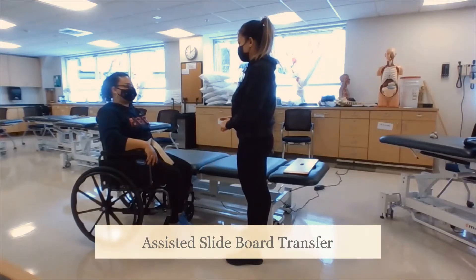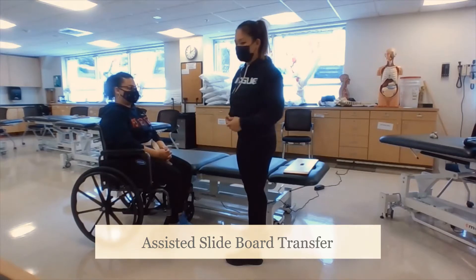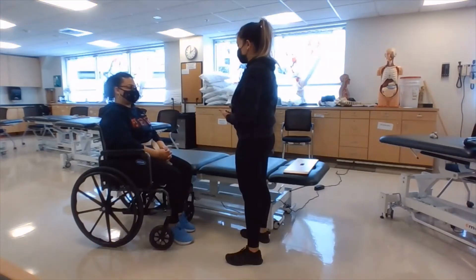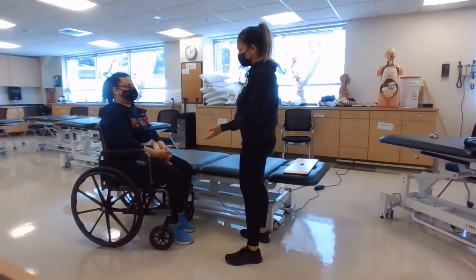This next transfer is going to be the assisted slide board transfer. We're going to get started by having the patient ready on the chair. The armrest closest to the bed is going to be removed. Of course the wheelchair is locked and the patient is going to have a gait belt on.